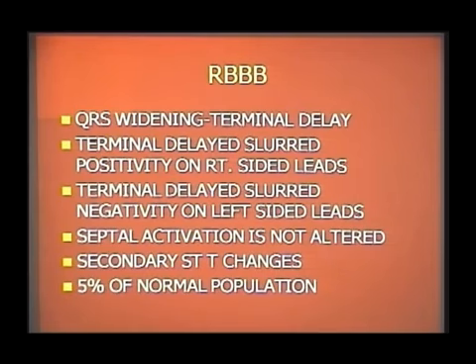Not all right bundle branch blocks are disease. You can have a right bundle branch block in 5% of the normal population. So the right bundle branch block is not always a disease. So this is your right bundle branch block.